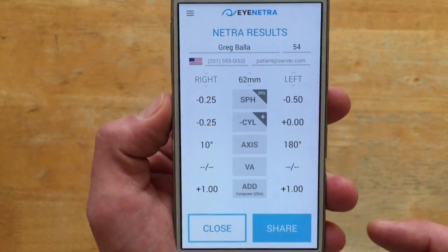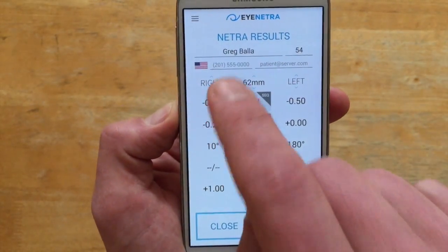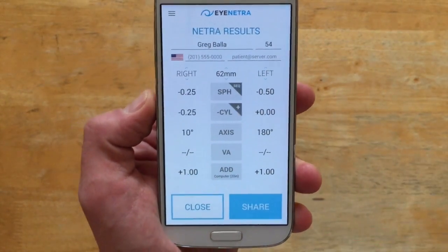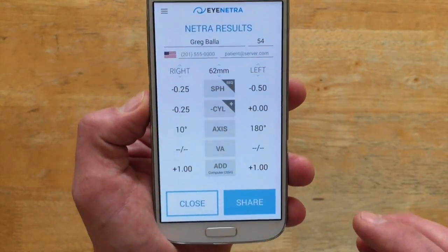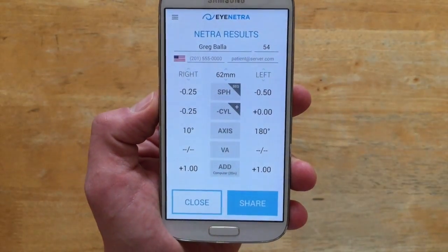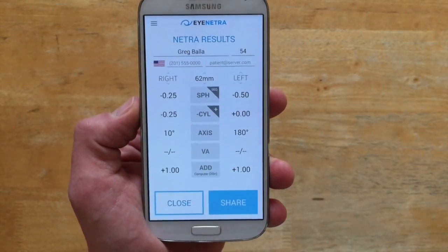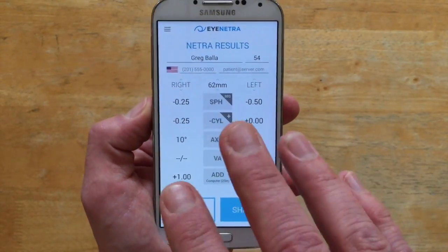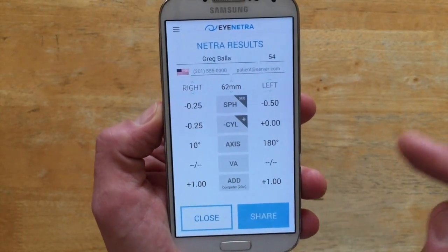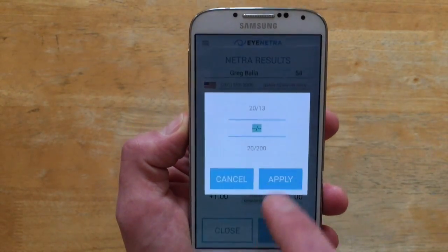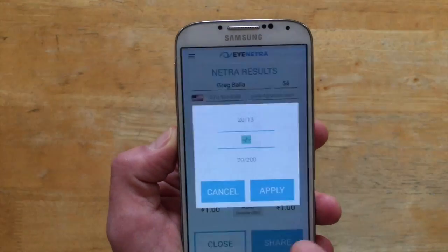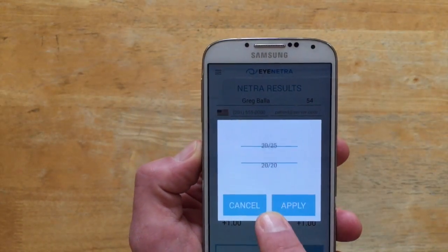Now we'll see how this refraction affects visual acuity. Maybe this patient came in today seeing about 20/40, we gave them a Netra refraction, and now we put the powers into the phoropter and record how the patient is seeing. On the right eye we got them down to about 20/25 — not bad. Same thing on the left eye, down to about 20/25.